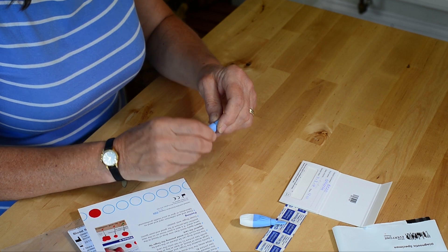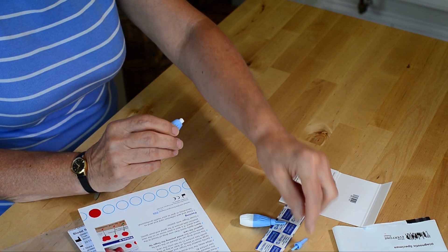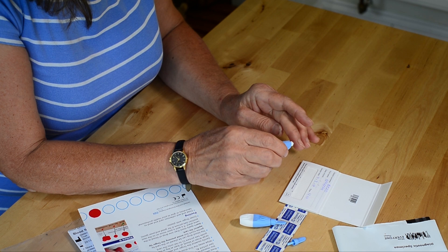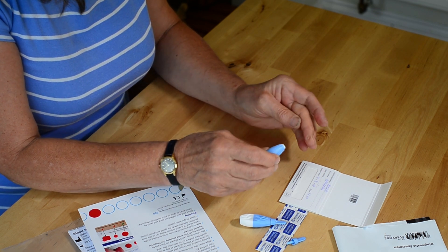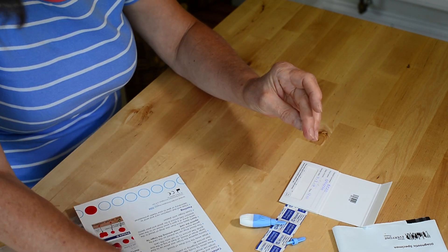Firstly twist and remove the protective cap from the lancet. Press the white tip firmly against the side of your chosen finger and pierce the skin. Wipe away the first show of blood.